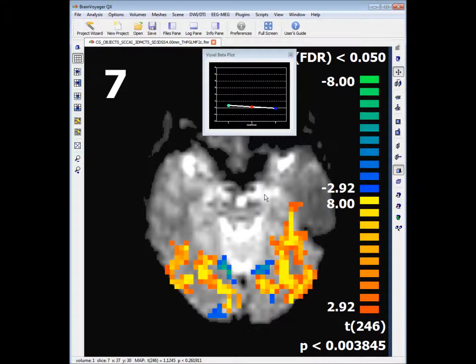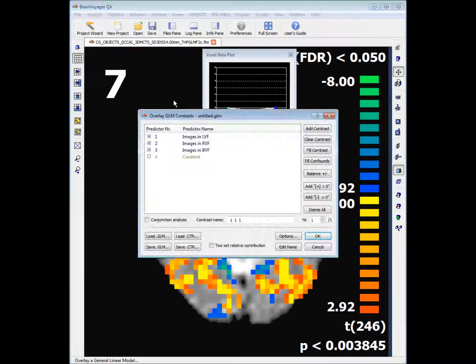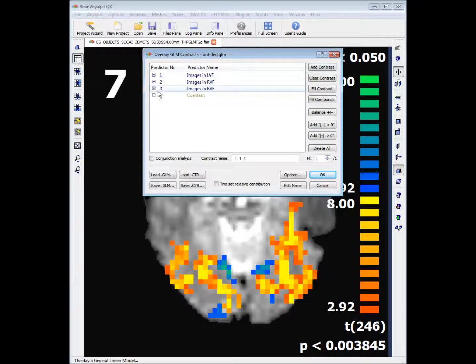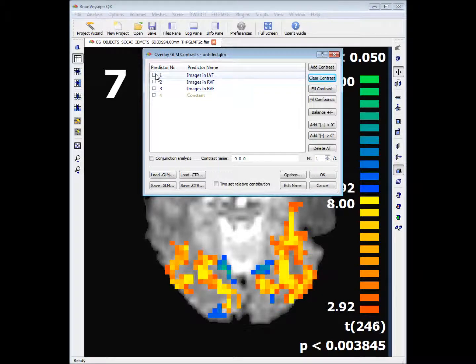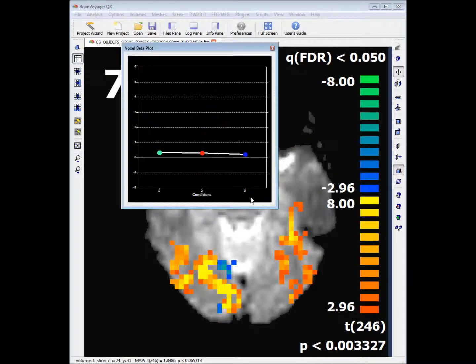Now that we have our GLM fitted to our data we want to ask the GLM some questions. If we go into Analysis we can click on Overlay General Linear Model. You can see on the left hand side here we've got little boxes with plus marks in them. If we clear those away by double clicking, and then put a cross for Images in the Left Visual Field and click OK, what we'll be left with are points where that predictor explains the variance in the time course for each voxel.